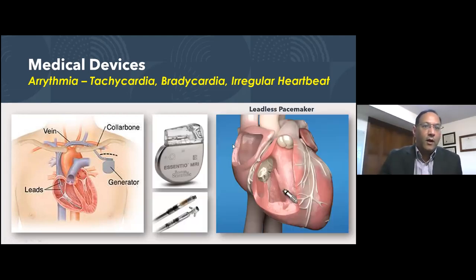Now, one other new innovation happening these days is with these leads. I talked about how some of these leads have to stay there for a long amount of time, and people grow. When kids grow, the length and size changes. In that case, you have to pull the lead out and insert another set of leads. As the lead sits there, tissue grows around it, so extracting them is a huge deal.